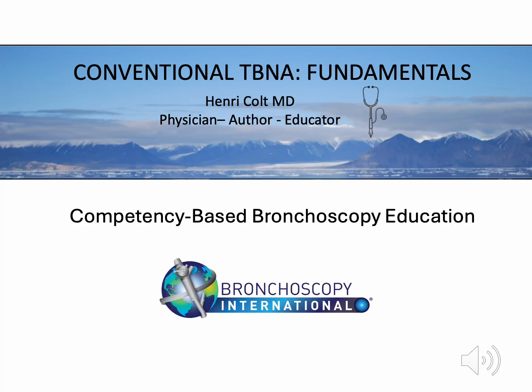This is Dr. Henri Colt, and this presentation is part of Bronchoscopy Academy, an ongoing competency-based curriculum in flexible bronchoscopy. The goal of this work is to improve procedural understanding, anatomical recognition, and clinical judgment, while helping reduce patient suffering associated with unequal expertise and inconsistent training.